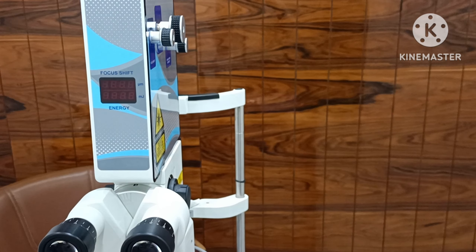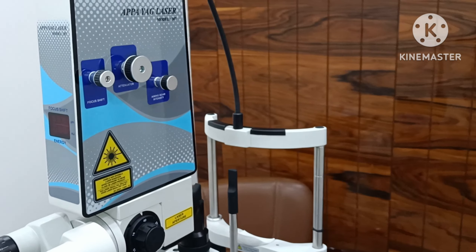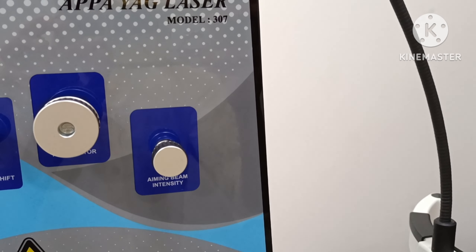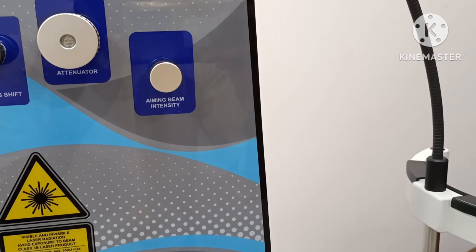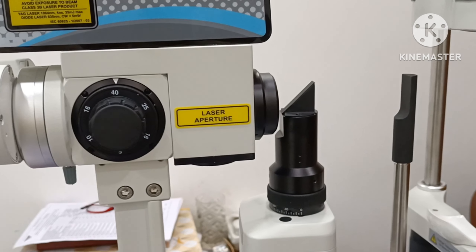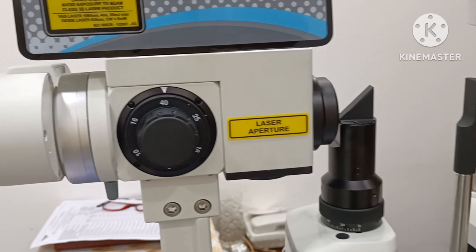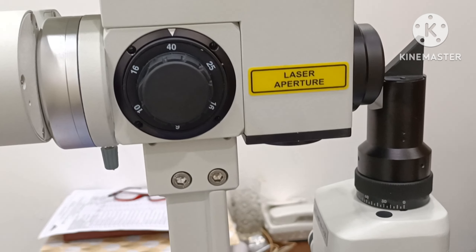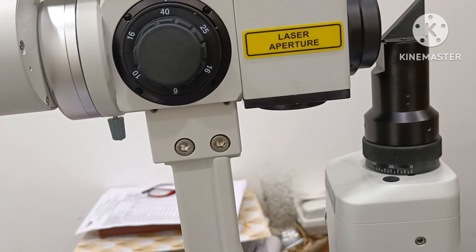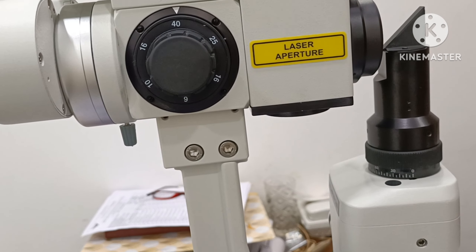ND YAG laser model 307. Laser aperture: 6, 10, 25, 16, and 40.